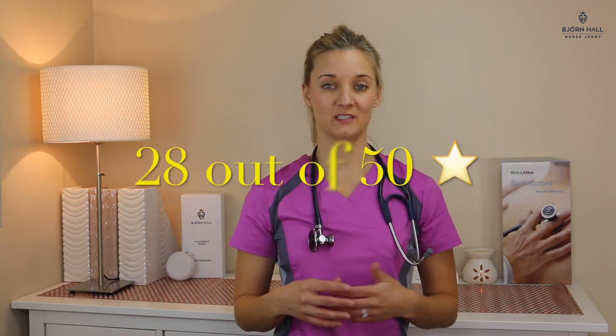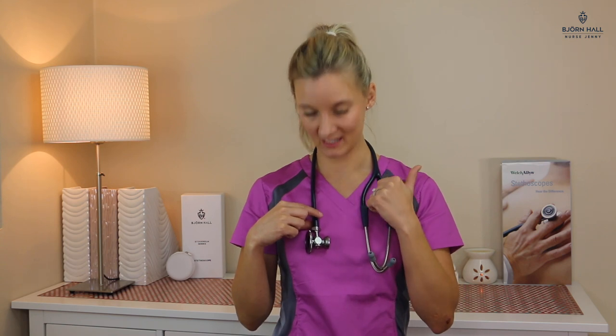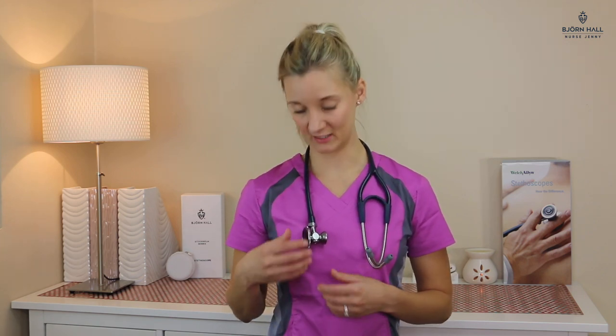The Welch Allen Harvey DLX Navy Blue Stethoscope has received a total score of 28 out of 50. The positives are that it has got a dual lumen tubing which gives great acoustics, and the little wing feature on the stem is quite nice. The overall trumpet feature of the chest piece is really unique. What lets it down for me is the overall weight — the chest piece is really heavy, and the adult side as well as the bell can screw off on their own so you can lose them quite easily.